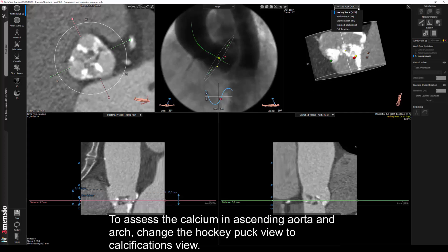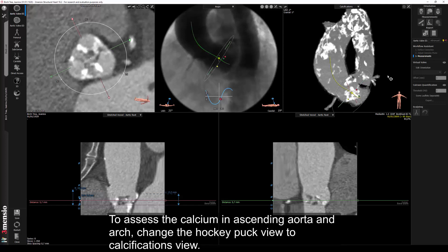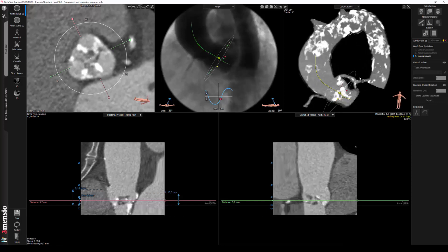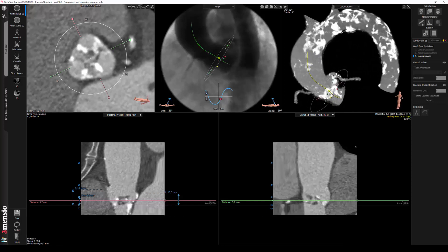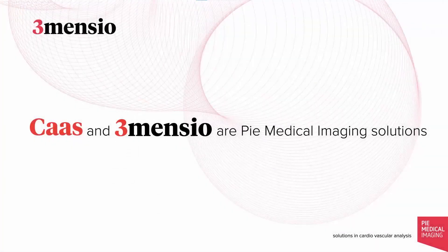To assess the calcium in the ascending aorta and arch, change the hockey puck view to the calcifications view.